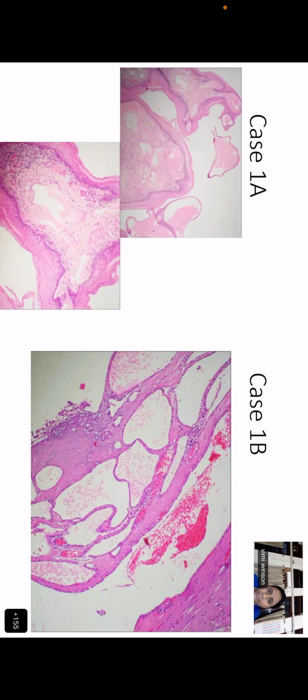Dia, do you want to change that word secretion? Yes, ma'am. I was wrong. Now I am getting it, because I would have used secretions only if there was any lining to it. Means if there was any cuboidal or some columnar lining, then only some space would have secretions.